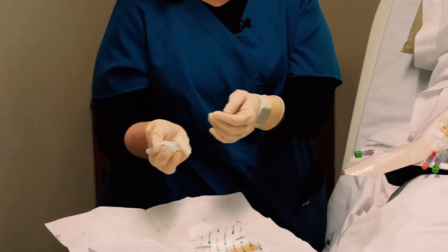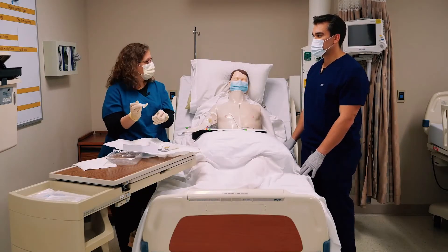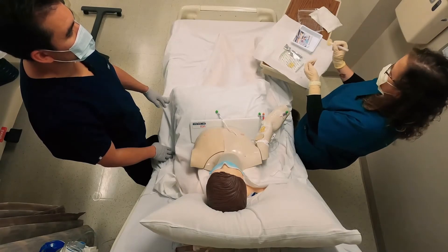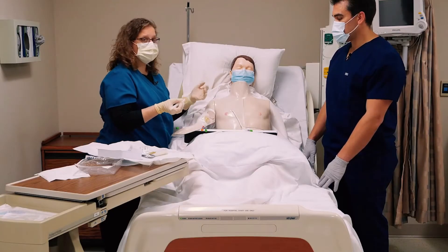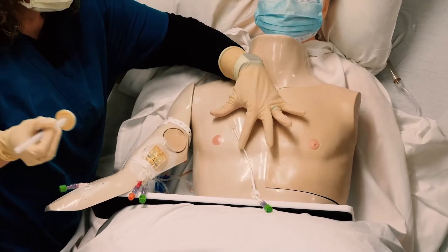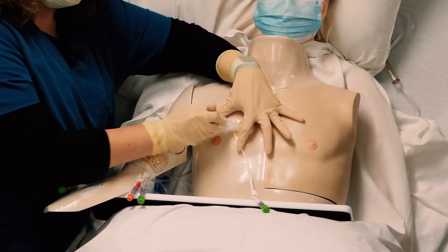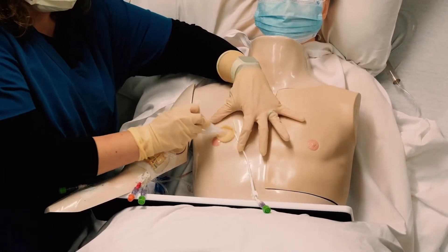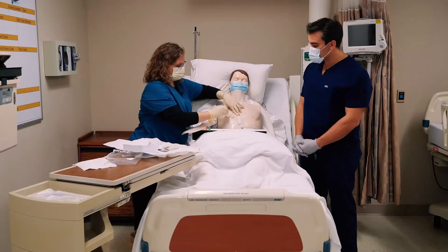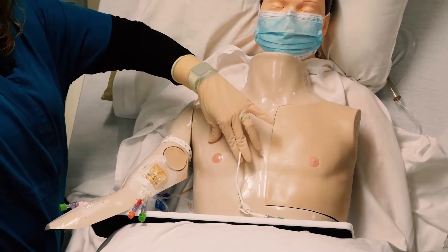You want to think through how you're going to do this. This hand is going to be my dirty hand, and this one will maintain my sterile hand. I'm going to stabilize and start at the center, going back and forth, making sure to get under that catheter so it does not move from the skin. Then — potentially the hardest part — I'm going to let it dry.